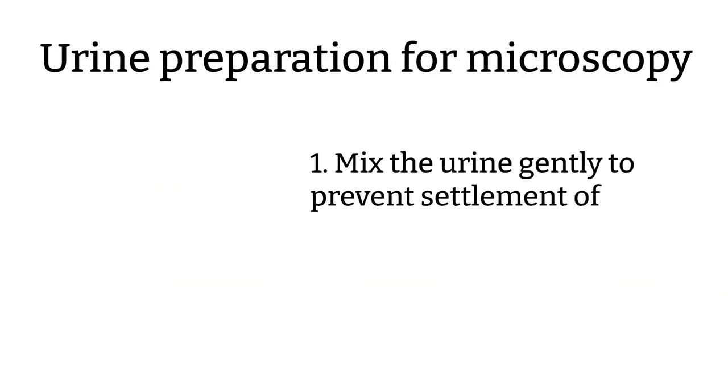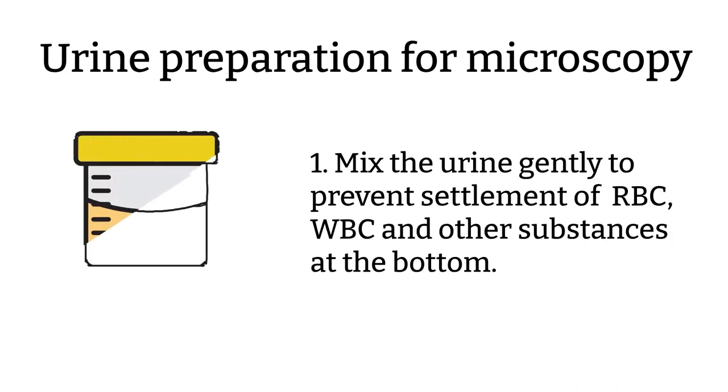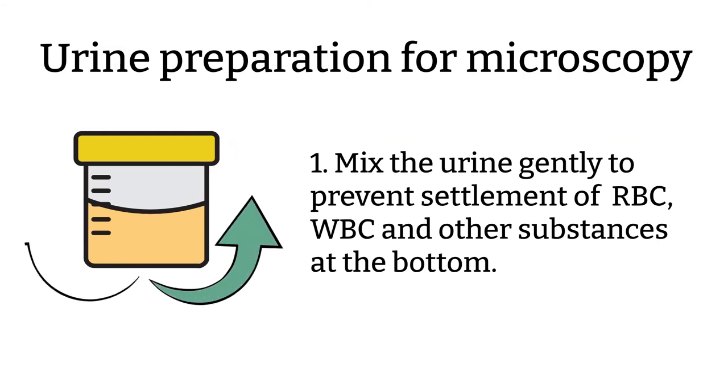Preparation of urine for microscopy. First, mix the urine gently. Do not shake, because you don't want to create bubbles, or if the container is not closed tightly, you may end up with some of the urine on yourself. The reason you want to mix the urine gently before microscopic examination is that if you leave the urine sitting for a while, red blood cells and white blood cells can settle to the bottom and you may miss those.